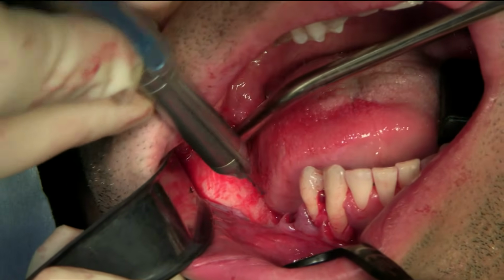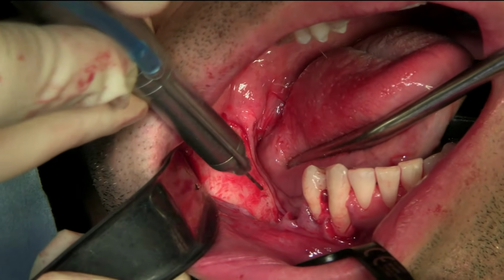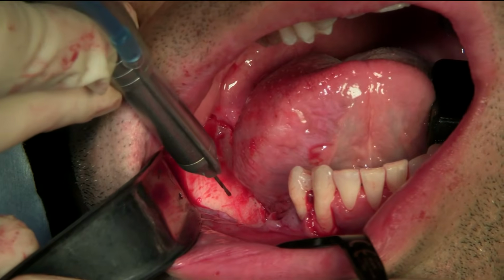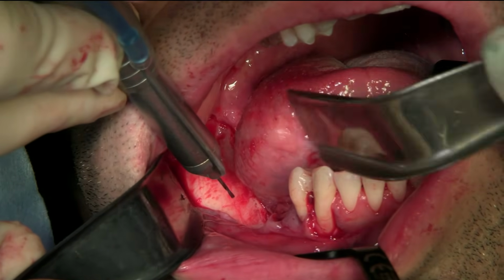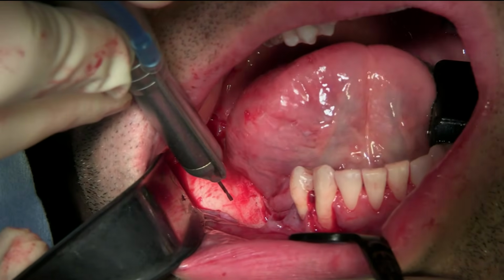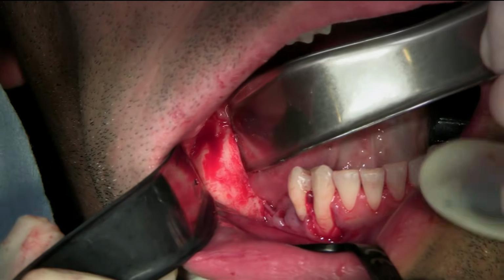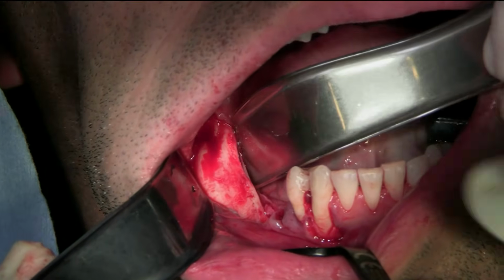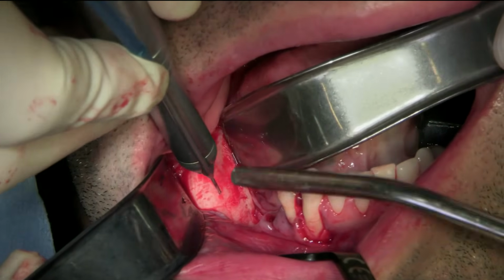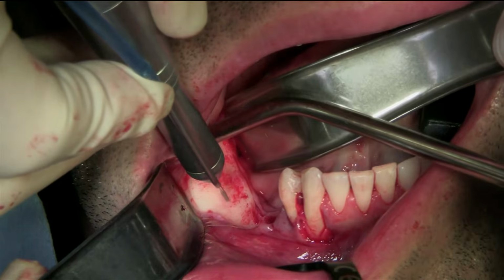His tongue, retract his tongue here. Come on this side here. Hold on, Dr. Taking this. I think you need a mirror. Okay, so here's my straight handpiece. Go in the back. Go in the back of the mouth.